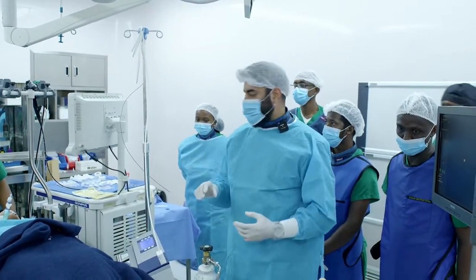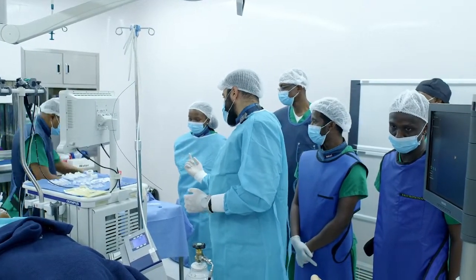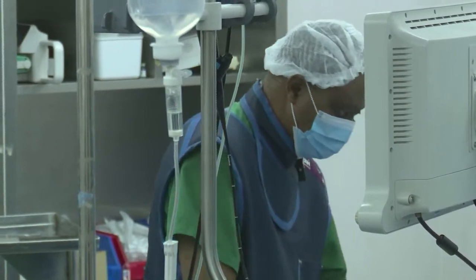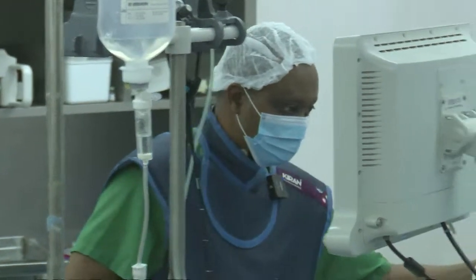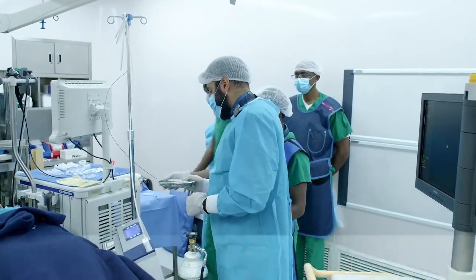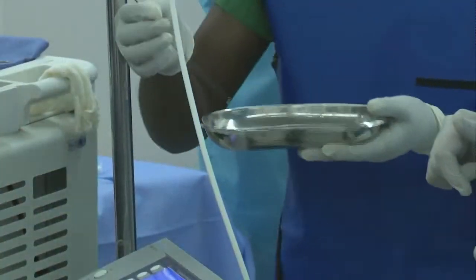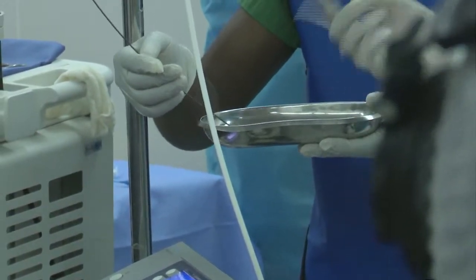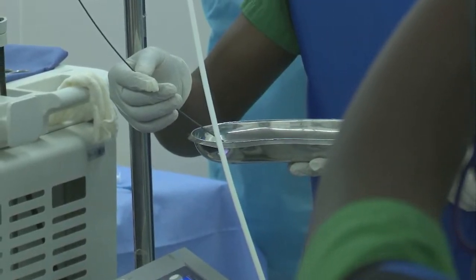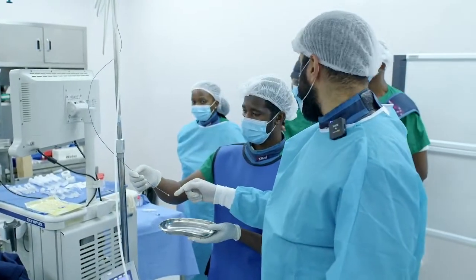And usually when we do it, the first thing we do is we test our equipment. So I'll ask Dr. Waweru here to do a little ice test. I'm going to put the probe in some saline, and I'll ask you to step on the pedal. So put it in the saline, yeah. Okay, so just freeze like 5 seconds. 1003, 1004, 1005. Yeah, you can take it out. There you can see the little ice ball at the end of it.